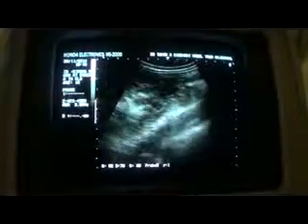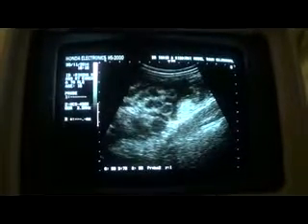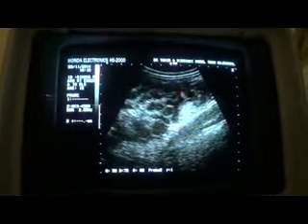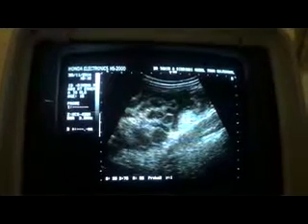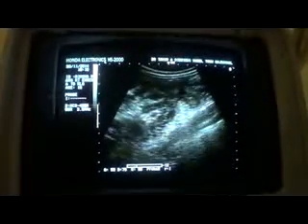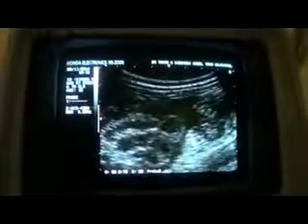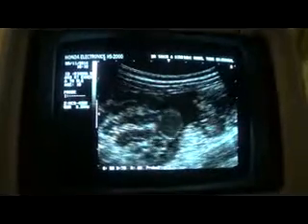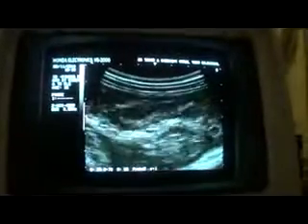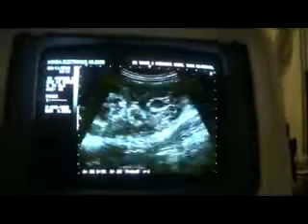This is all fluid, and the bowels are floating in this fluid. You see, these are all bowels. You can see the movement of these segments of bowel, and this area is representative of fluid, with this being the left iliopsoas muscle. Note the movement of the vessels within the fluid. The vessels appear to be matted together as per their appearance.